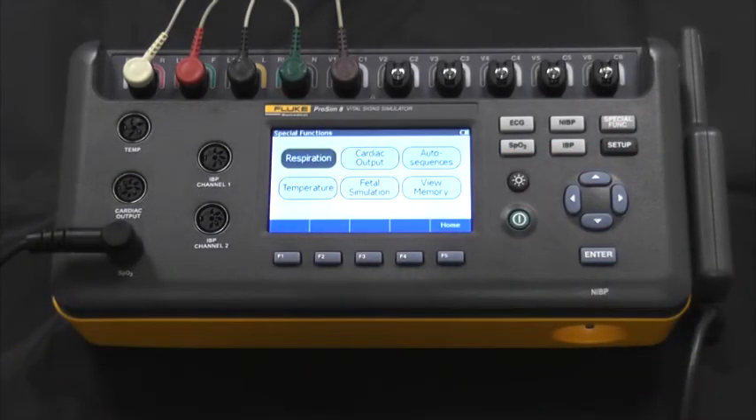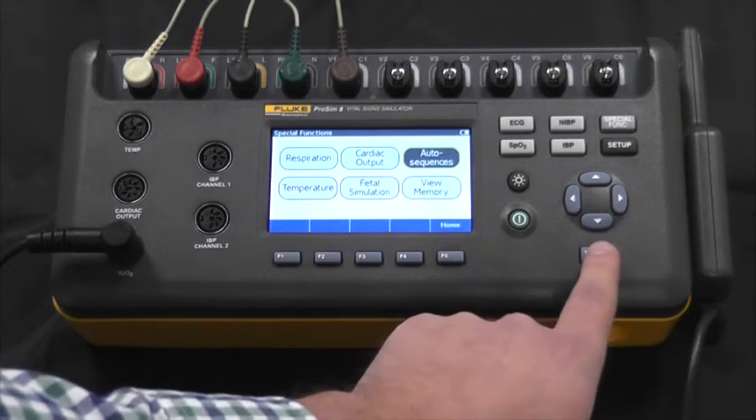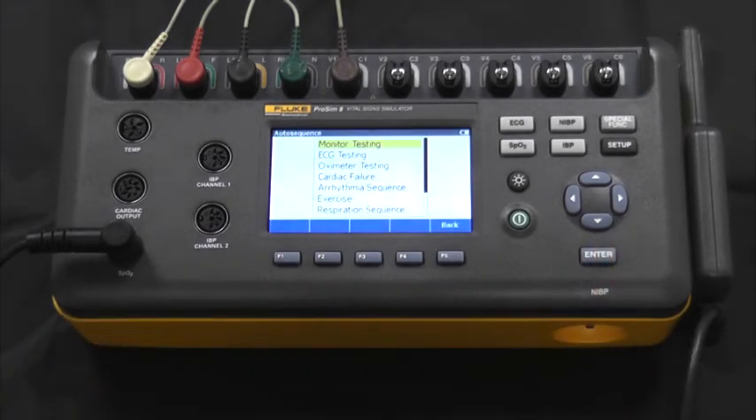Moving to special functions, we can see respiration, cardiac output, temperature, and fetal simulation. There's also the option to use auto sequences. There's a list here, but you can also create your own.